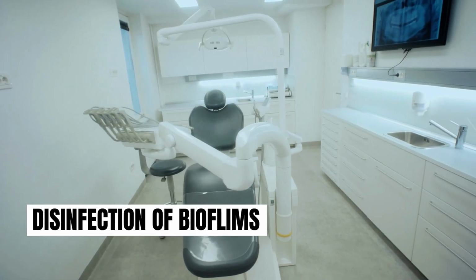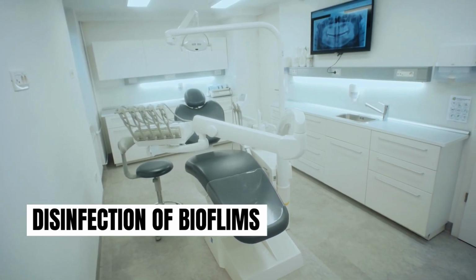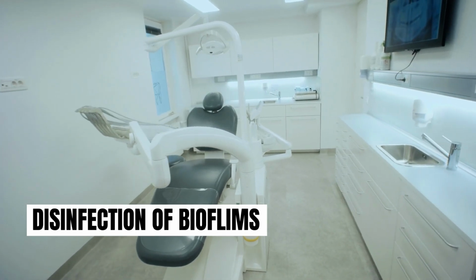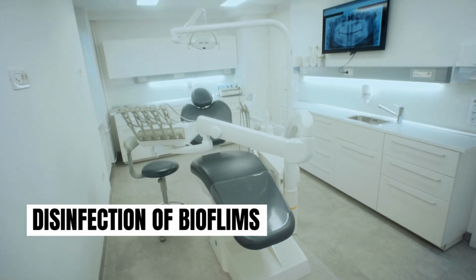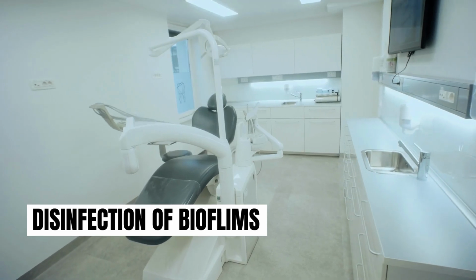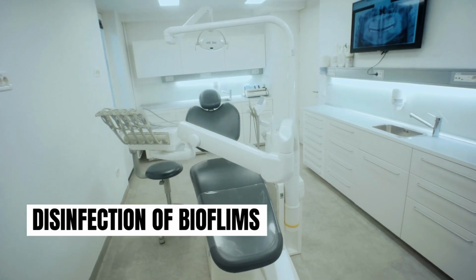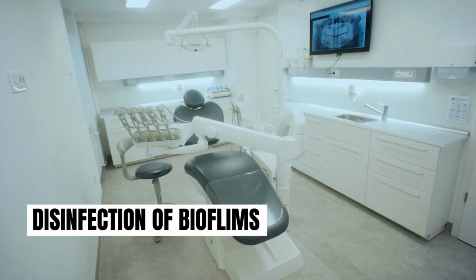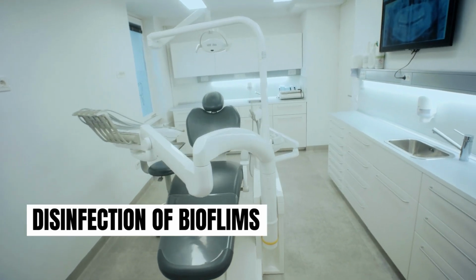The source of these biofilms comes from the environmental aquatic bacteria which can cause infection in vulnerable patients. So the commonly found bacteria in these handpieces include Legionella, Lactobacillus, Actinobacillus, Micrococcus, Staphylococcus, Pseudomonas, Klebsiella, Streptococcus, Staph aureus. So glutaraldehyde is advisable for disinfection of biofilms in these waterlines.